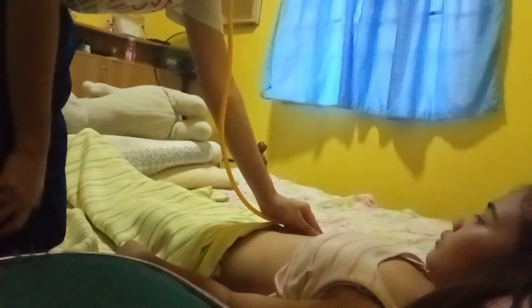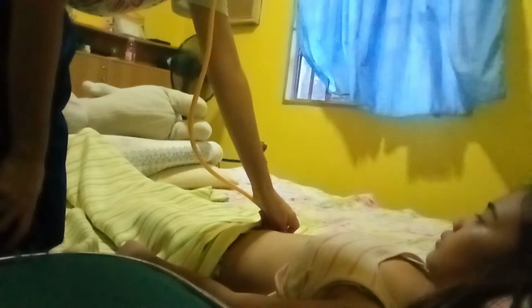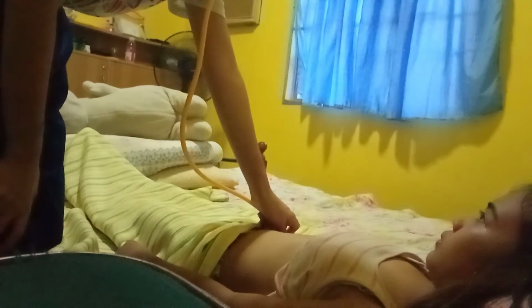So bruits can be heard on the abdominal aorta. So here. And it can also be heard on the renal artery. Also on the iliac artery. And femoral artery.